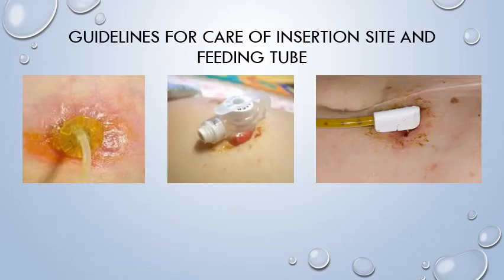Guidelines for care of the insertion site and the feeding tube will be given to you by the delegating nurse. Check the skin at the site for redness, irritation, or leakage of stomach contents. Be sure the G-tube is not becoming embedded into the skin. Notify the licensed delegating nurse if any of these are present.